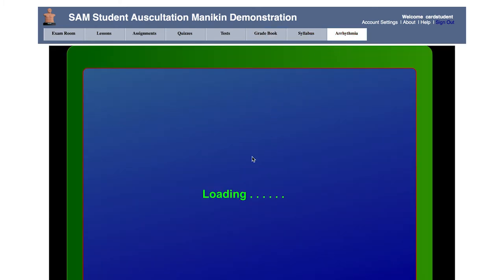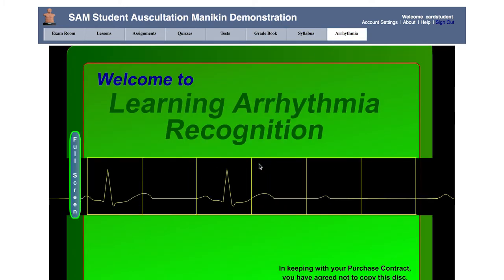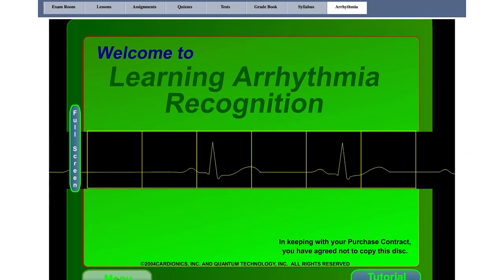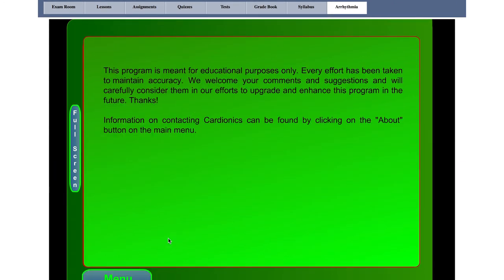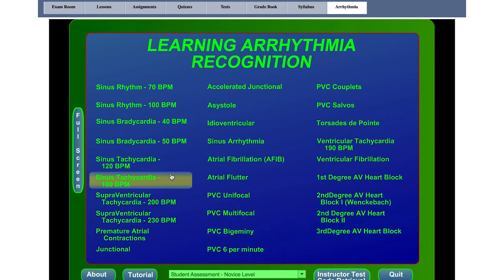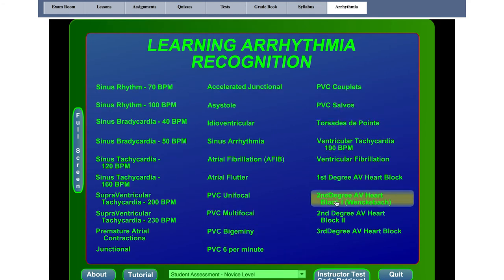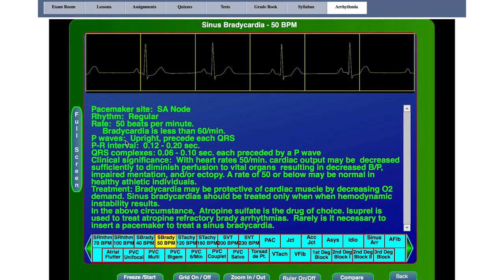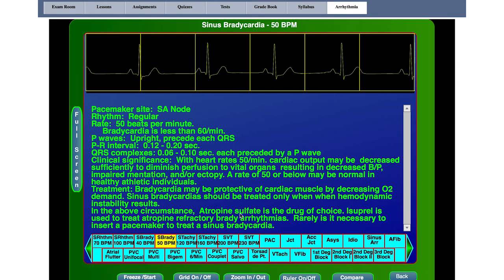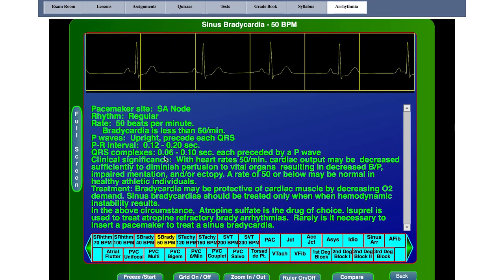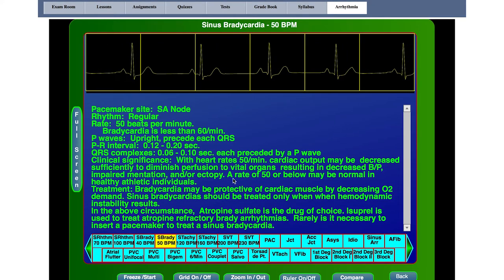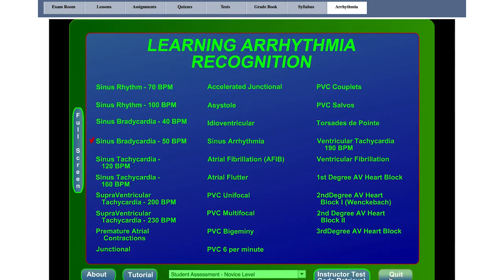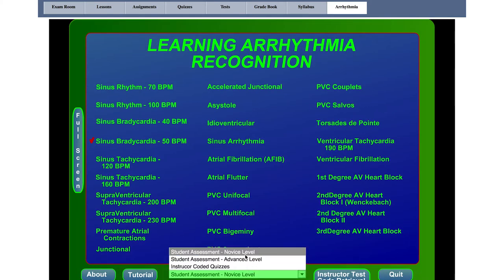SAM Online offers an additional tool for learning arrhythmias. This program includes nearly 30 of the most common arrhythmias and a thorough explanation of their EKG waveforms. Each lesson is supplemented with descriptions of the condition's clinical significance and treatment plan. Once students have reviewed the lessons, they will be able to assess their progress through either beginner or advanced level quizzes.